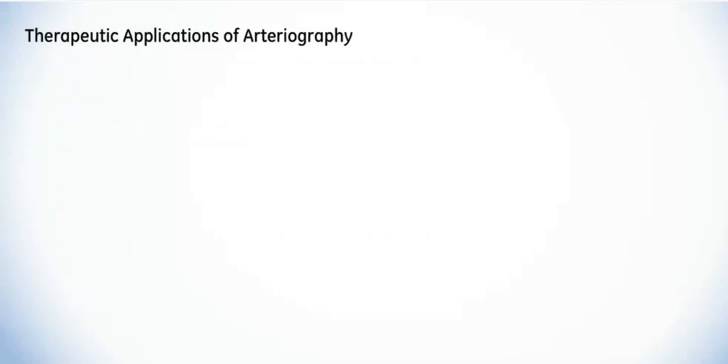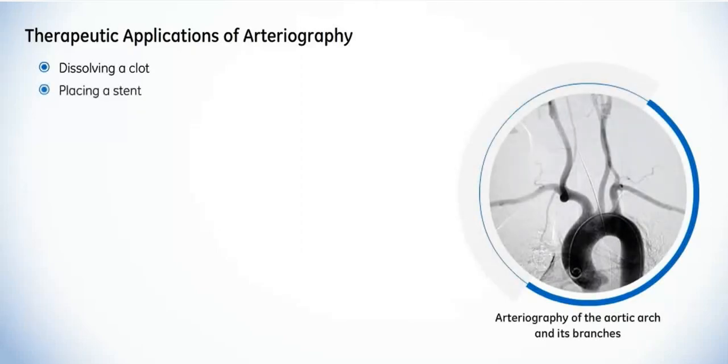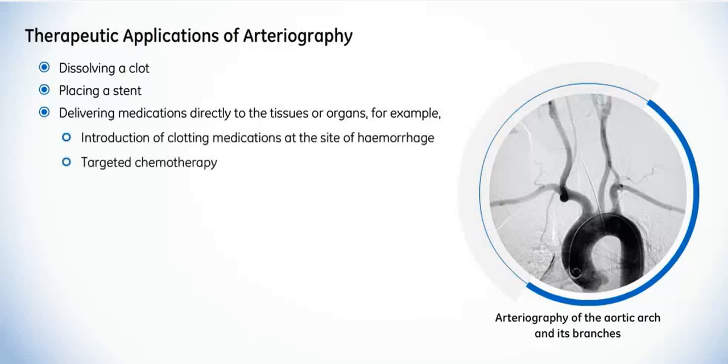It can also be used for interventional procedures, such as dissolving a clot, placing a stent in the blood vessels, and delivering medication directly to the tissue or organ for treatment, such as clotting medications at the site of hemorrhage or delivering cancer medication directly to the tumor.